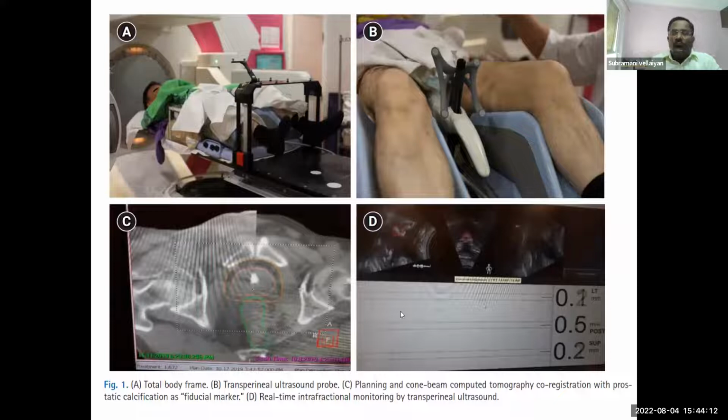So how is that being done? We have another system called the response gating system provided by Elekta. So we set that the tolerance should be there. In case it is exceeding that, say for example 5.2, then automatically it will stop the beam.